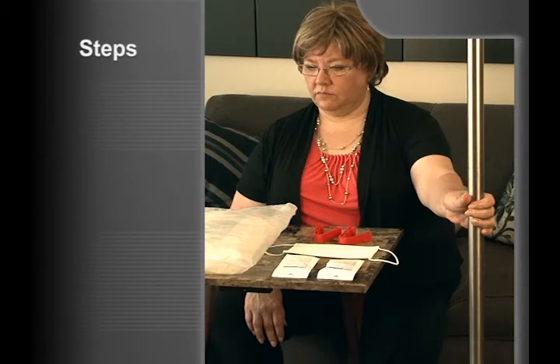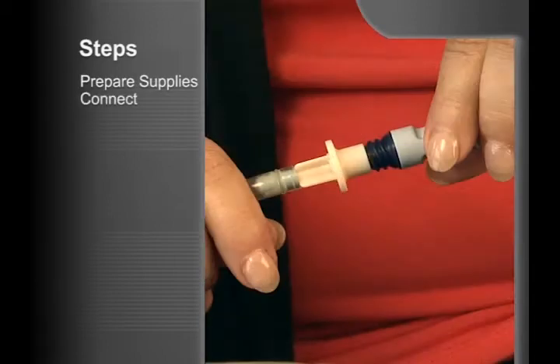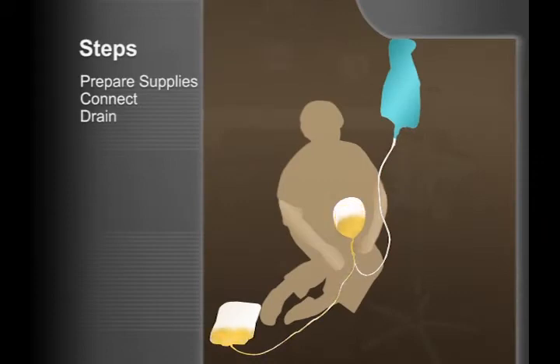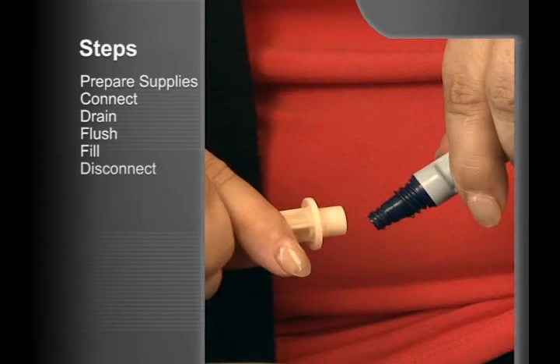Let's look at the six main steps of the UltraBag system procedure. Step 1: Prepare your supplies. Step 2: Connect to the UltraBag system. Step 3: Drain. Step 4: Flush. Step 5: Fill. Step 6: Disconnect.